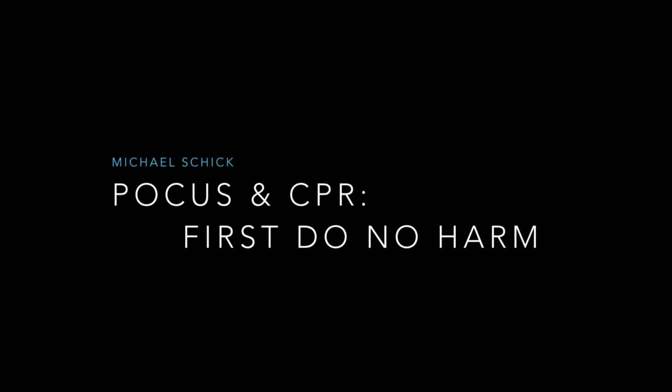So in summary, ultrasound has its place in resuscitation, especially in patients who are sick, and that includes patients who are under CPR. You can find some reversible causes. You can also look at rhythms in a different way and perhaps with more sensitivity than the rhythm strip itself. But you have to know what you're looking at, and you want to not interrupt CPR because we want to do no harm with ultrasound. We just want to do good by our patients.